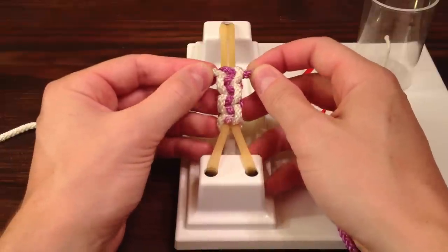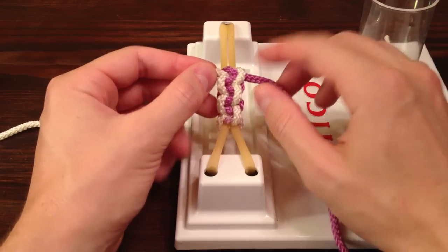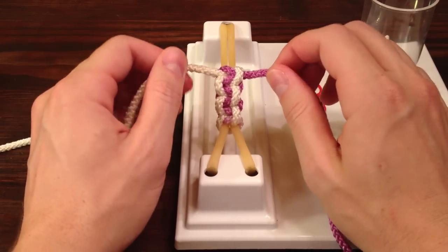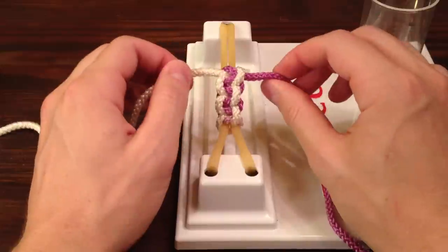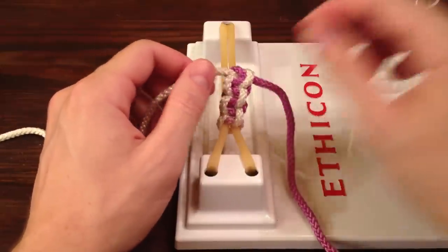You can tell that you're tying the right knots because the white is always going to be on the outside and the purple is always going to be down the middle. So there you have it — that is how to tie the two-handed surgical knot for left-handers. Good luck out there, and thanks for tuning in. Go Camels!